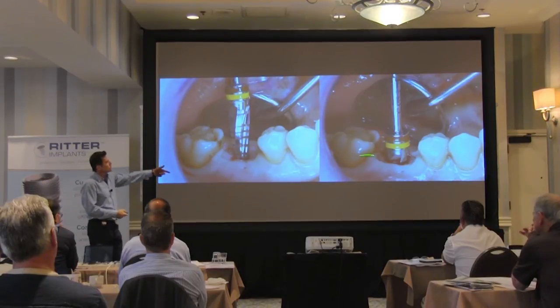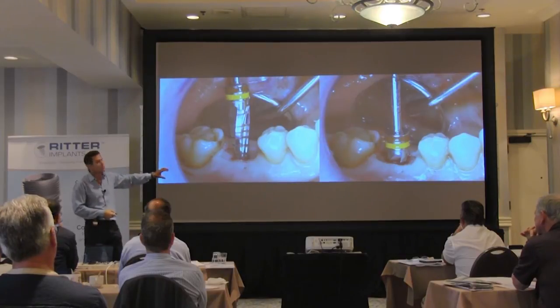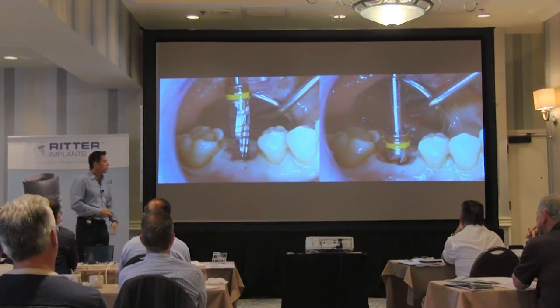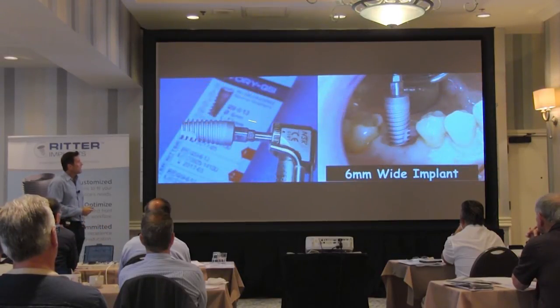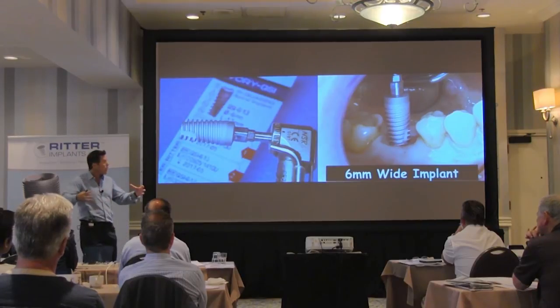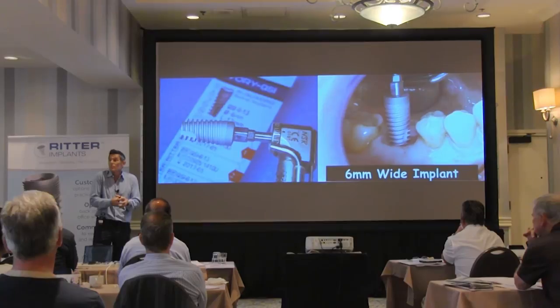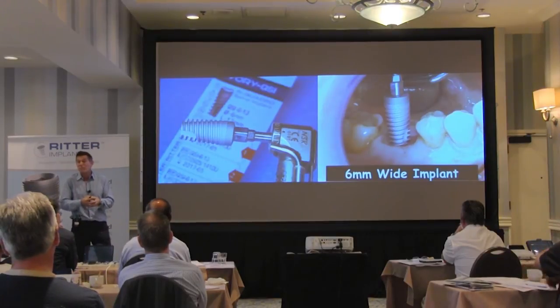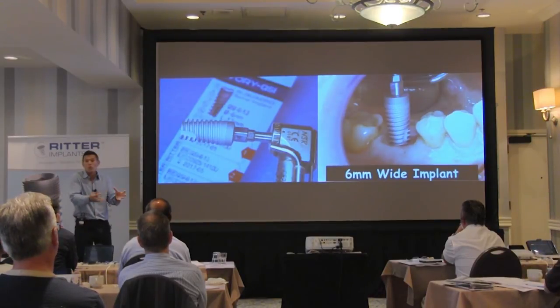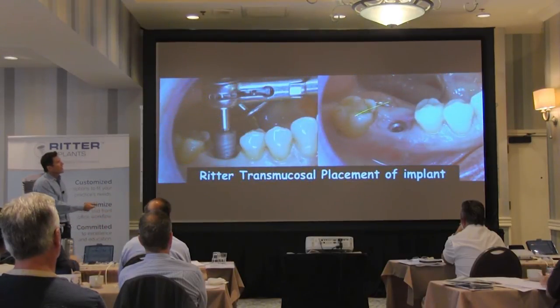You have enough keratinized gingiva — you don't have to move the flap around. I have my dedicated drills; I can go to my depth. I always want to leave at least 2mm of tissue posterior above the head of the fixture. I have my dedicated drills with stops. Here I'm using a wide diameter implant, so now I can place a wide 6mm implant for the molar.